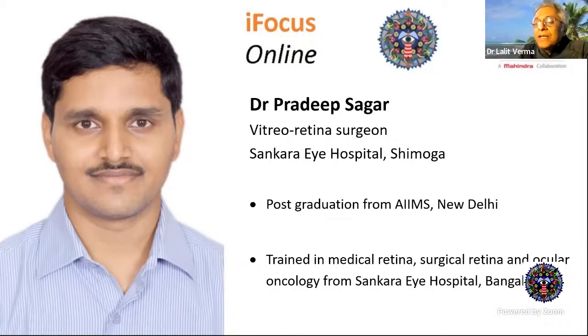Although we are tilting towards OCT for a lot of follow-up patients and OCTA also, angiography, I still believe, has a role. But everybody does not have OCTA also. That also should be kept in mind. So this lecture is important because all of us face all these vascular diseases, diabetes, vascular block, ARMD, and so many other mechanisms, tumors, Coats disease. We still depend on angiography for diagnosing disease.